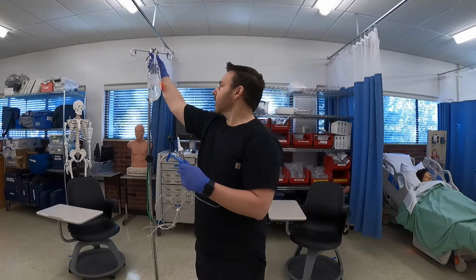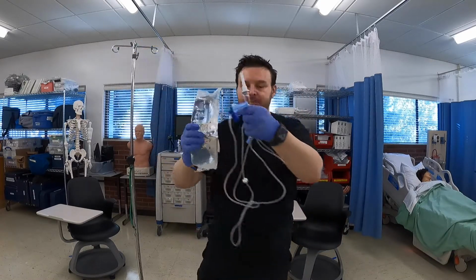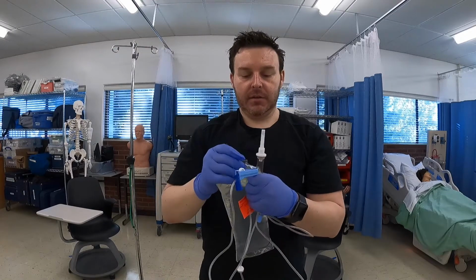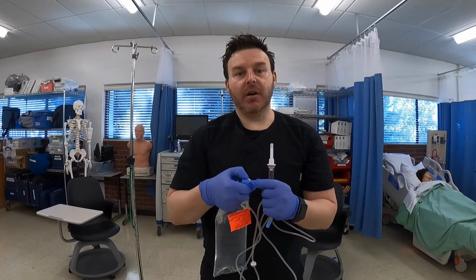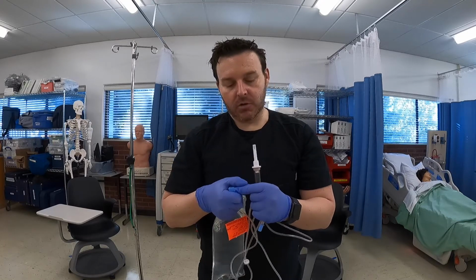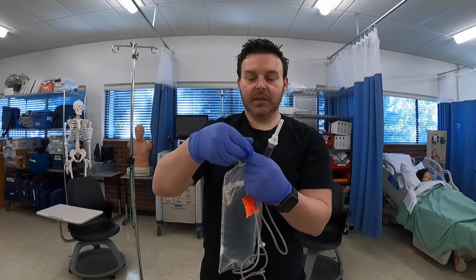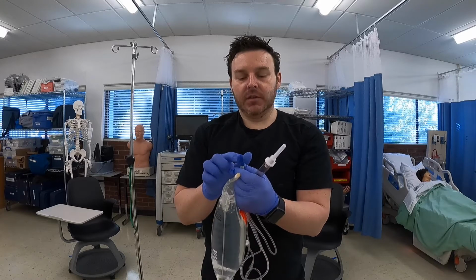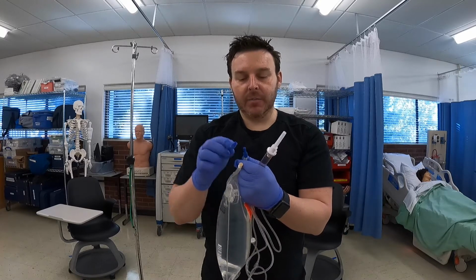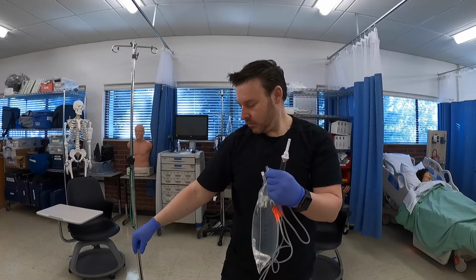So I'm going to grab my IV bag, and you want to make sure before you do this that you have your clamp in the off position, because you don't want all that fluid running out. So what I'm going to do is I'm going to take this blue tab. Again, this one is for medication, and then this is going to be the one where we're going to actually spike the bag. So we're going to go ahead and just pull this off, just like so.